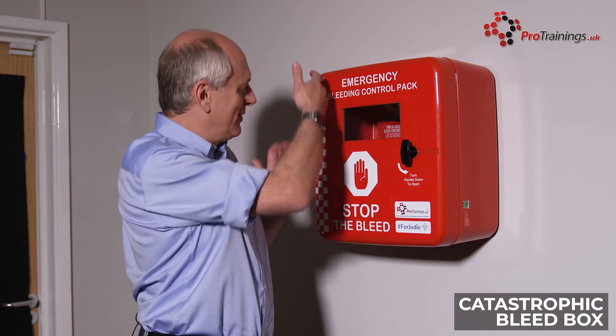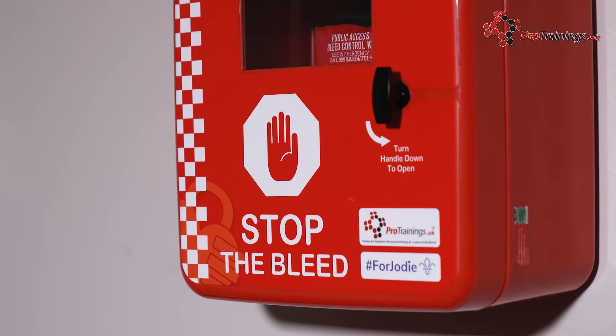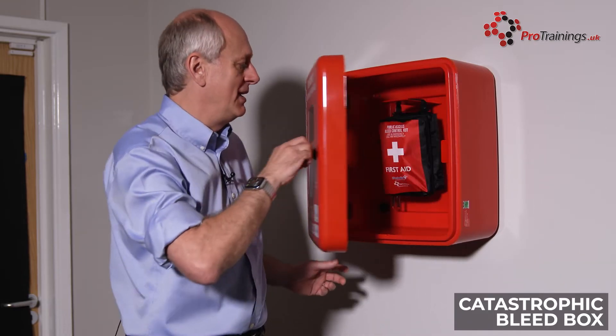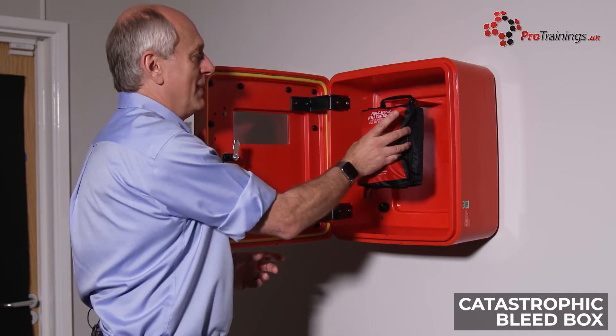The outside of the box is very clear and very bright — it is obvious what we are trying to do as a bleed control box, and the idea is that as many people as possible know where this is. To open the kit, you turn the handle, open it up, and then you can grab the kit nice and easily out of the box and use it.